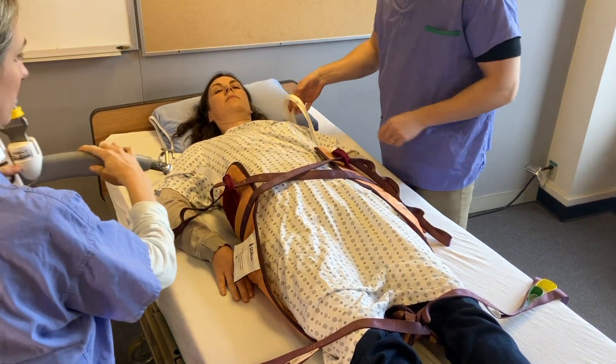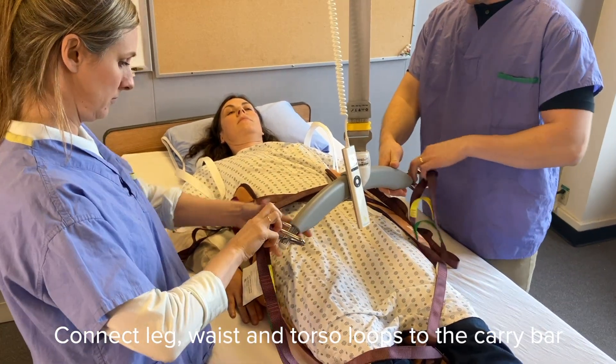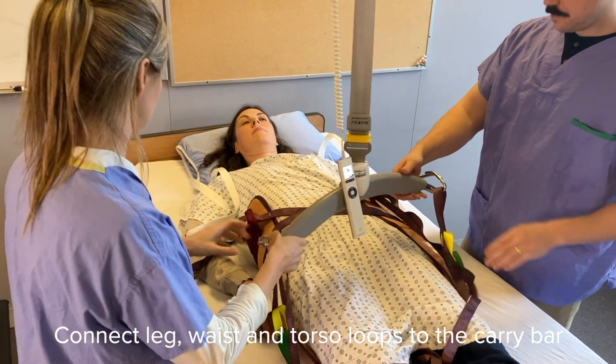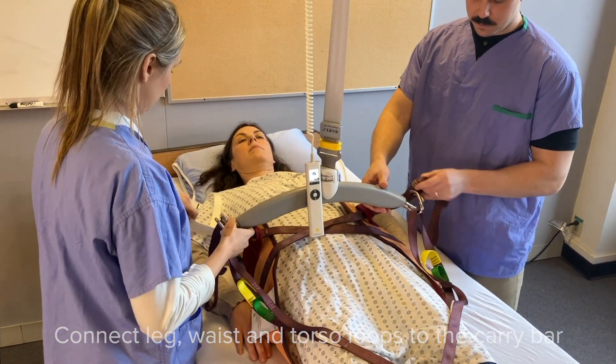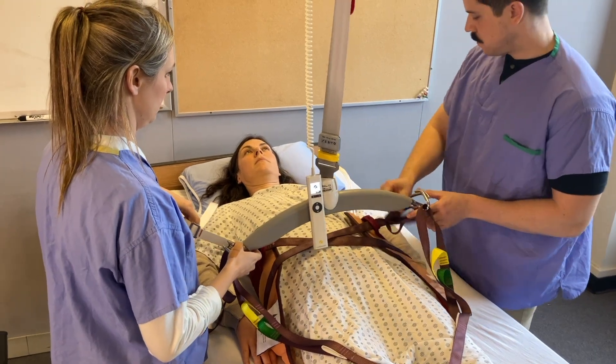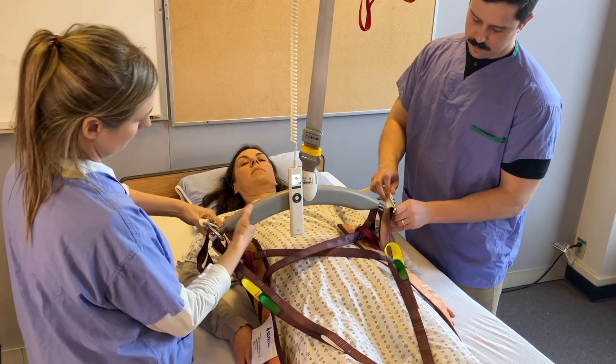Position the carry bar of the patient lift over the patient and connect the loops to the carry bar. Aim for longer loops at the bottom and shorter loops at the top — this will better facilitate your patient into a sitting position. Ensure that the chest straps or backpack style straps are attached.